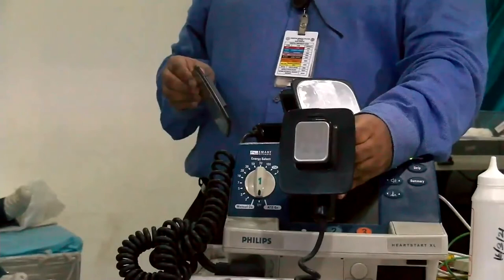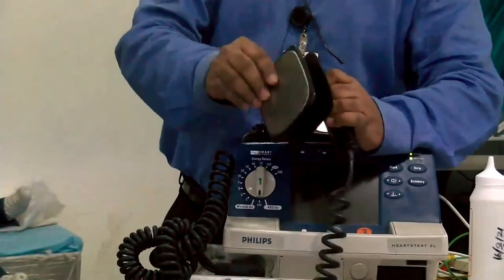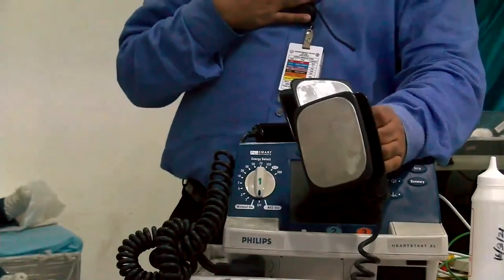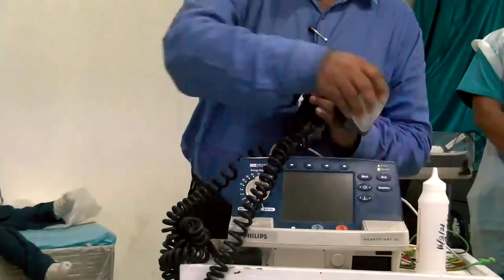You need to remember, any model of defibrillator will have this, and then you can use it for young infants. You can also use it in the anteroposterior position, as Vandana was saying. So the first step you have taken, and then you need to have the gel in place. You need to apply it, that is very, very important. And then you will charge.